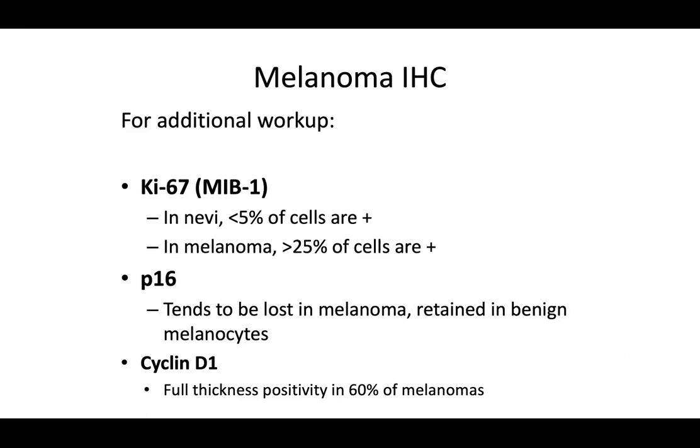And a good example of that would be a study that I did on acral melanomas, and I found that plenty of acral melanomas still had a lot of P16 positivity, but they were architecturally melanoma in situ, they were architecturally acral melanoma, and they were clinically and pathologically acral melanoma, diffusely PRAME positive and diffusely Ki-67 positive, high proliferation rate, diffusely HMB45 positive, and in some cases even molecular supported the diagnosis of acral melanoma, but P16 was still retained.